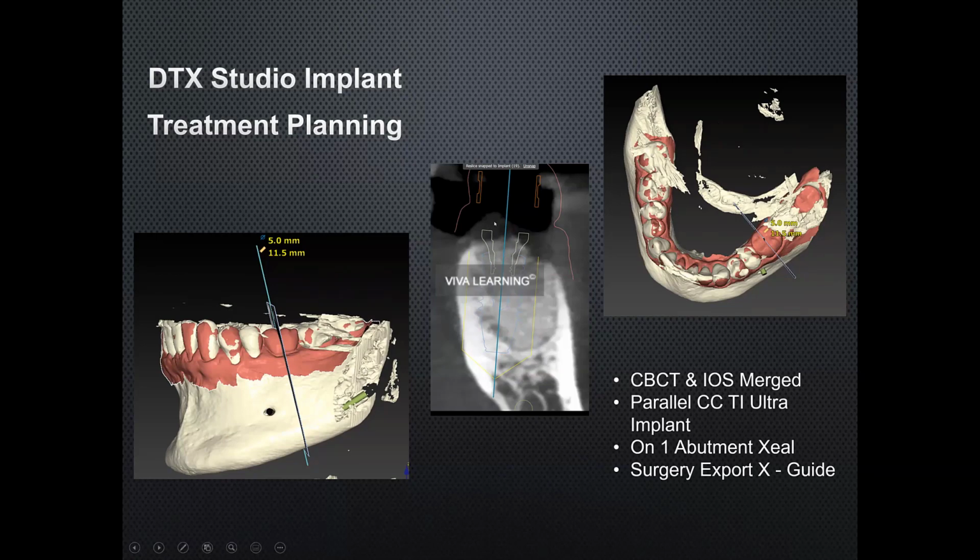soft tissue. Our studies are showing us now that if we can stay a little taller on our abutment, at least 2.5 millimeters away from our implant abutment interface, it's going to help us reduce any marginal bone loss, and also help us reduce peri-implantitis.